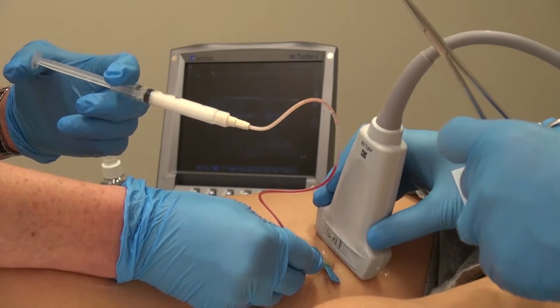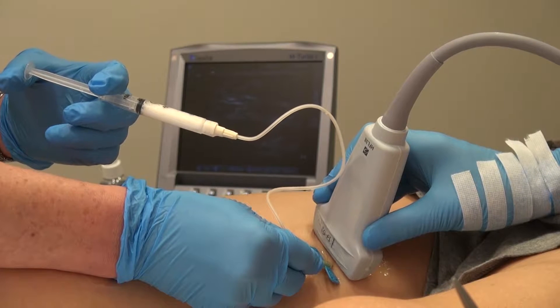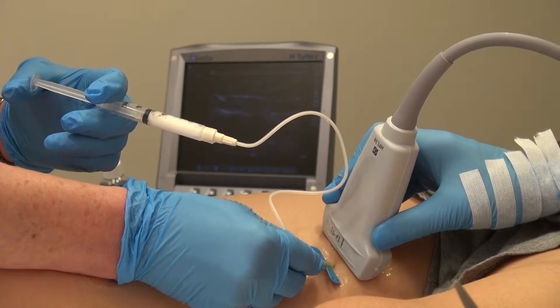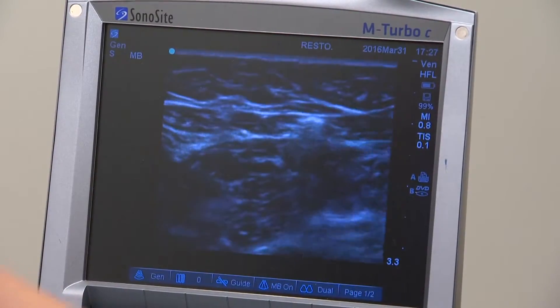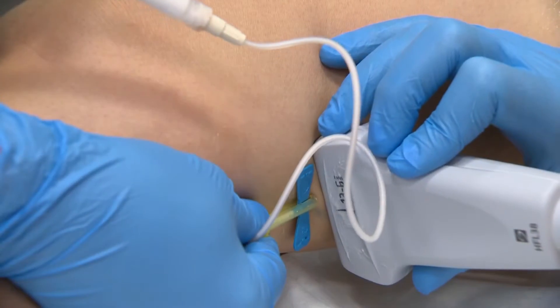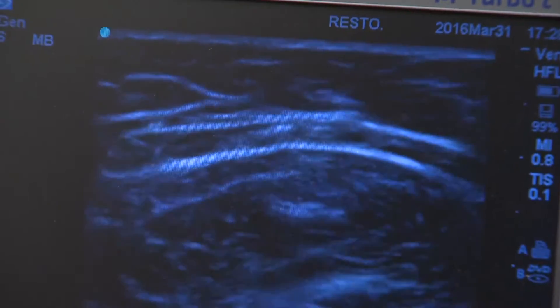Foam sclerosants are much stronger compared to liquid sclerosants and result in much less medication being used. The foam is then injected into the vein. An added benefit of foam sclerotherapy is that we can see the medication on the ultrasound. This is because gas is echogenic and easily seen on ultrasound, whereas liquid is not visible. We can ensure the medication is within the vein and follow it to see how much of the vein we have treated.